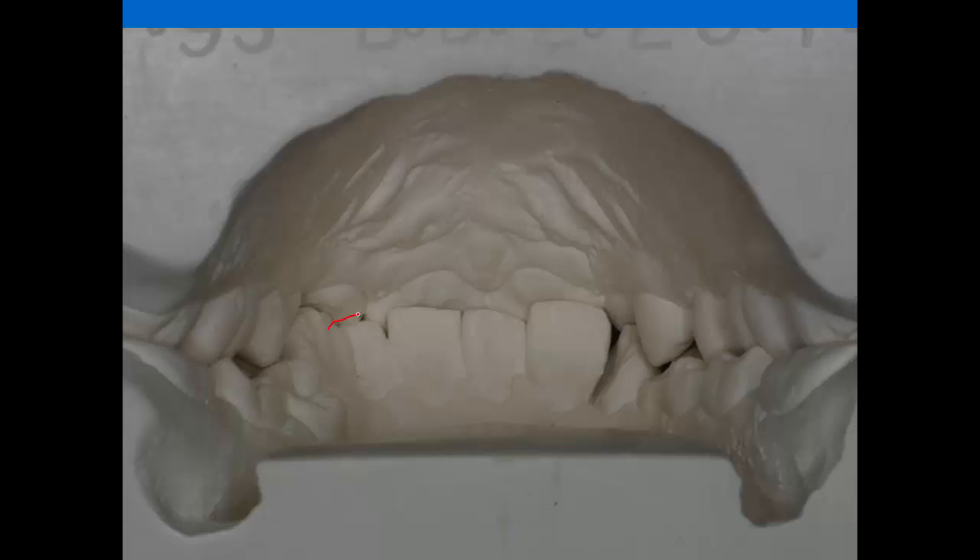Now, we had a deep bite on this case. We lowered that down. And we've got ways of opening anybody's bite if you need to. If you learn how to use these intrusion wires, they're the best thing going for opening bites — use blocks along with them. And that ends all of this stuff on cuspid for laterals. I hope, if you aren't used to doing this, try it. Get some cuspids you've removed and trim them up — just trim teeth and learn how to do it. It is not difficult to make them really look good.